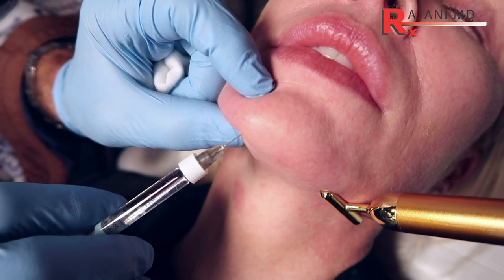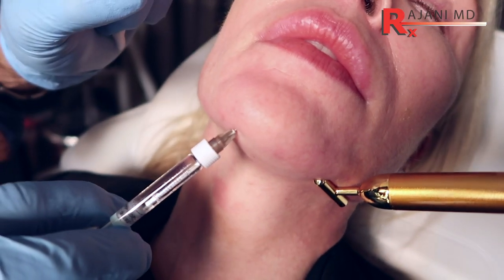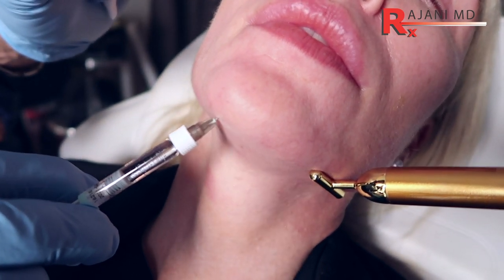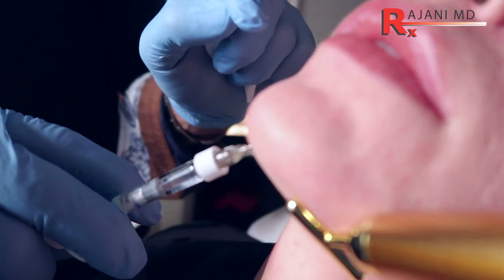So here's the first poke here, and if I do pull back — even though it's an avascular area — you're really mimicking an implant, so you're bolusing. I'm bolusing half a syringe; you could do more. It takes some volume. You can see it lifting up off the bone and coming forward to create that angle right here.